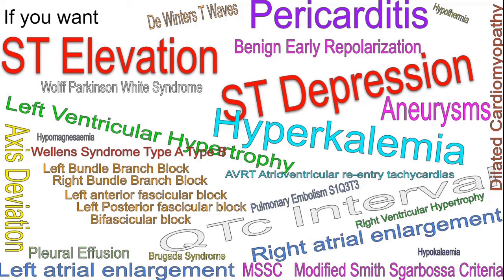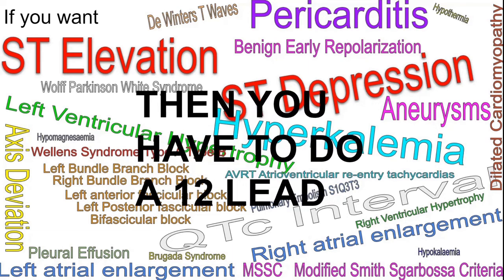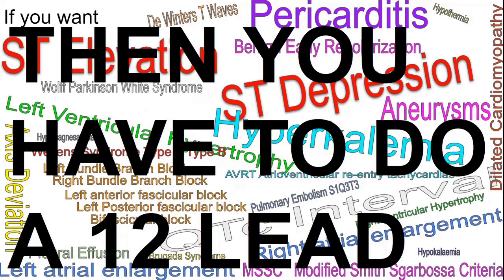So if you want to know more information other than just a rate, just a rhythm, then you're going to do a 12 lead. And if you do a 12 lead on the Tempus Pro, then you are going to have to place the limb leads on the thighs and deltoids or on the wrists and the ankles. And so if you want accuracy and you want all this extra information, then you have to do a 12 lead. And if you're doing a 12 lead, then you have to have proper placement.